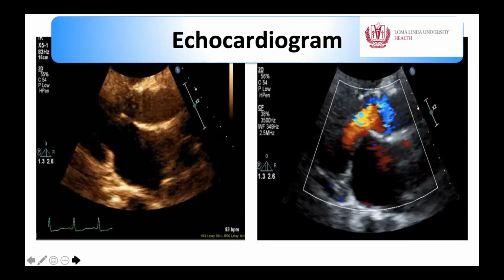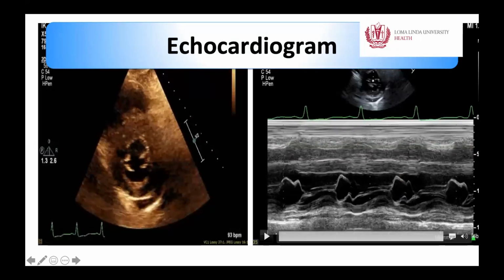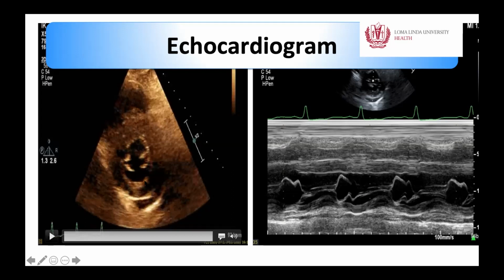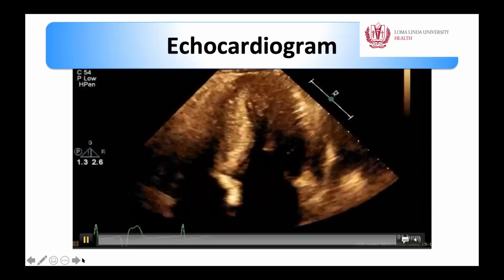I think I have an M-mode on this patient. Let's see. Okay, so here is the M-mode, and you can again see septal hypertrophy, but in diastole the mitral valve opens and in systole it remains closed, so there is no systolic anterior motion of the mitral valve. This is a normal M-mode of the mitral valve, and based on this you can pretty confidently say that there is no systolic anterior motion. So perhaps you are not going to find much of an LVOT gradient, although the patient does have asymmetrical hypertrophy, which we can very well see in multiple pictures. Just another picture here for you.